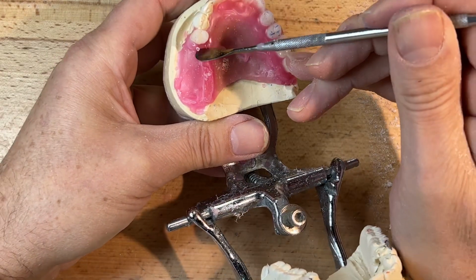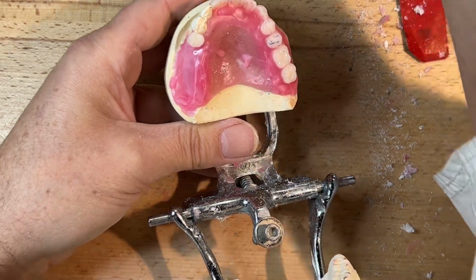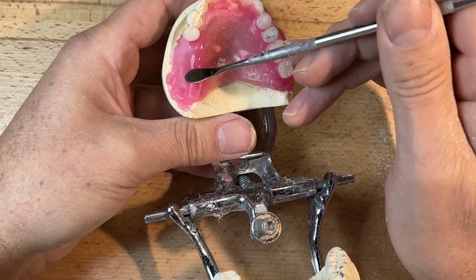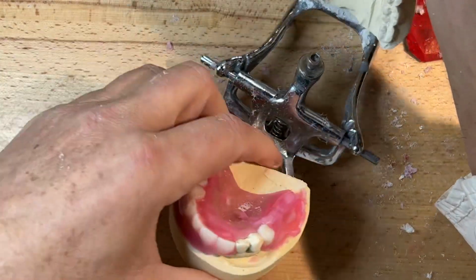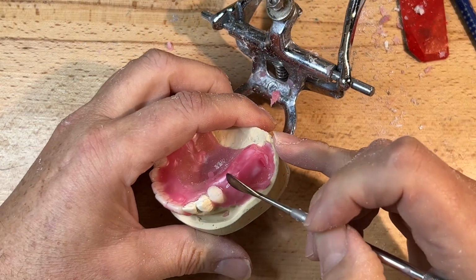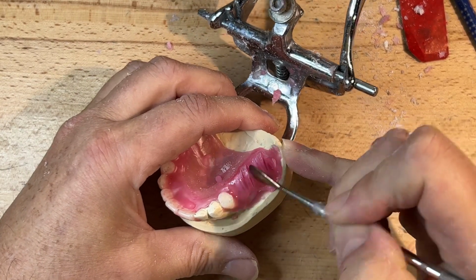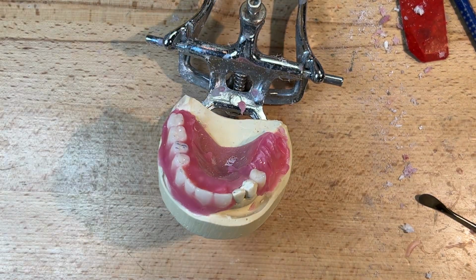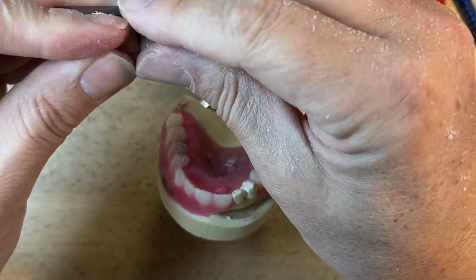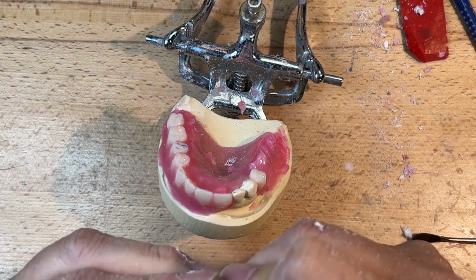Most dental technicians work obviously very differently. I've seen some that just keep the whole thing soft. I'm in no rush. I don't have another 20 cases to set up today. A couple more, but there is no immediate rush. No one's chasing me to finish. And I want to try to do the best I can do for each one.